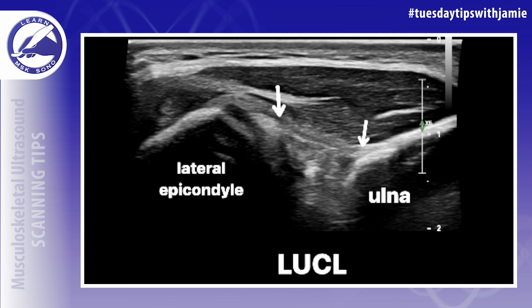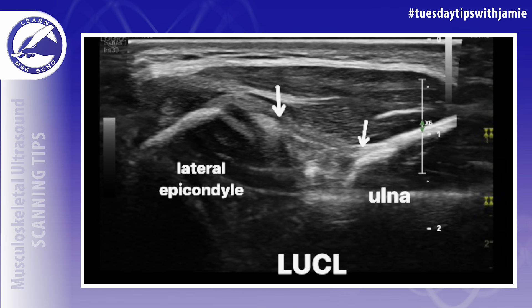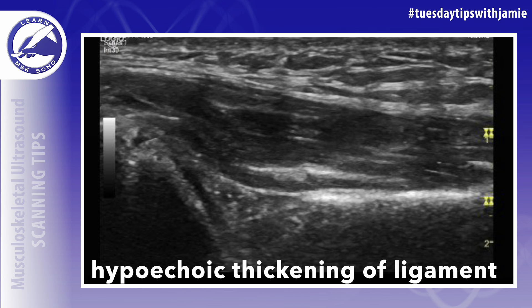The normal appearance of the LUCL is a thin hyperechoic ligament, so enlargement or disruption of it is easy to recognize once you get the scan technique down.